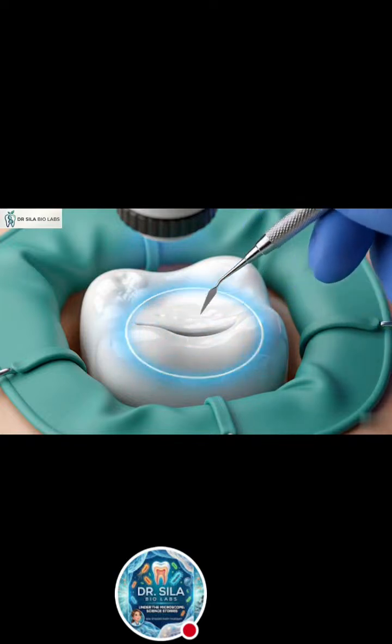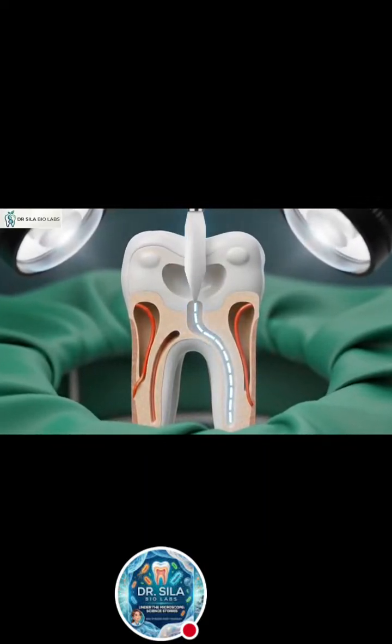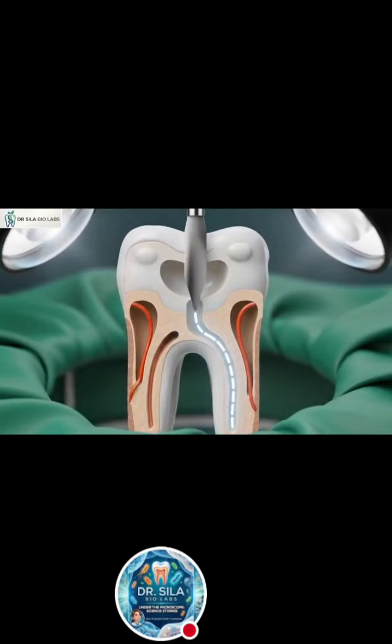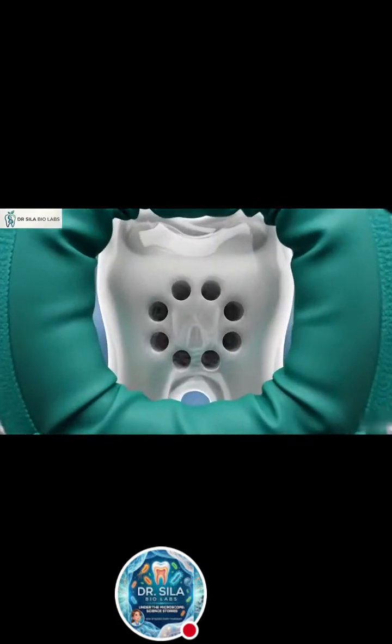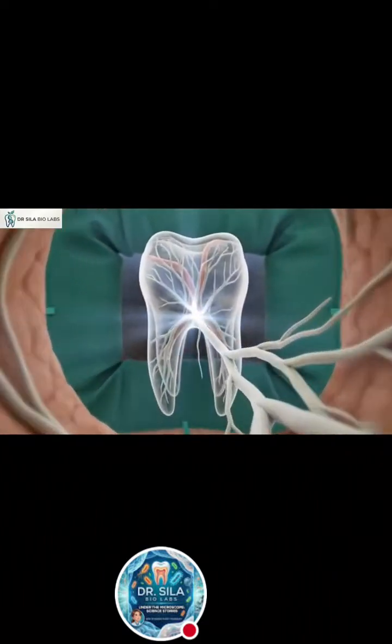The glowing blue overlay. A properly designed access cavity is essential because it allows instruments to reach the full length of the canals safely and efficiently. Access opening, the gateway to root canal treatment.